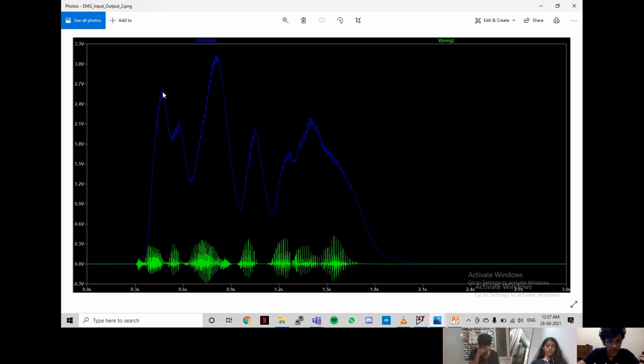So for example, if the threshold for left turn is around here at 2.5 volts, the operator will have to give 2.5 volts, and the value will increase from 0 till 2.5. In the path, when it is increasing, it will cross the thresholds for multiple other motions. Let's say it crosses the threshold for forward. So for the whole range, the output at the wheelchair will be forward motion. So that is avoided if we give an output only when the peak is reached.